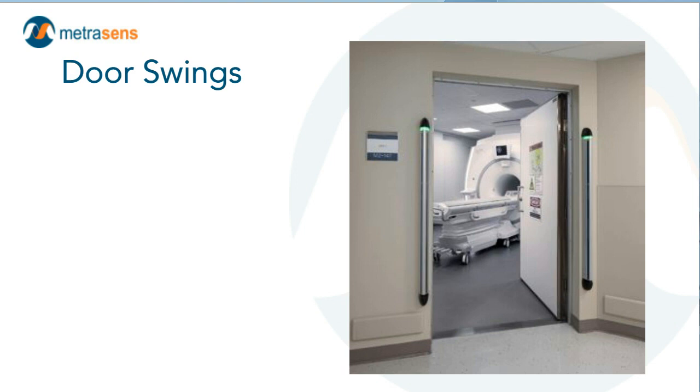So the notion that the outward swinging door is just going to get pushed open when the pressure builds up inside the MRI scanner room really doesn't work with a latched door. And so having doors that swing whichever direction you want is okie doke. It's not a problem anymore. So swing the door either way.